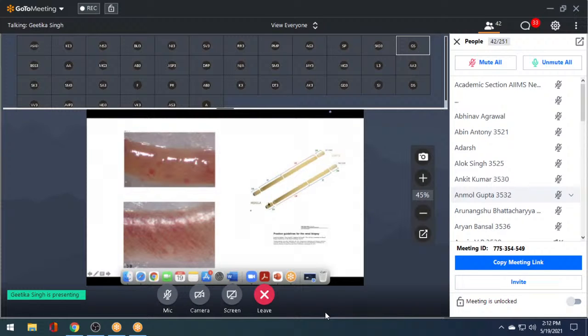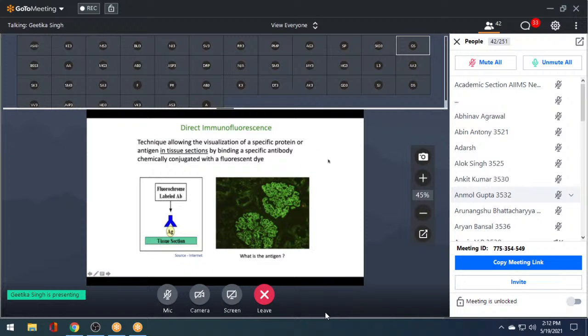So the way we divide it is not so important for you to know. What is important for you to know is we must divide it. If you're looking at kidney pathology, you need to have LM, IF, and EM. You need all 3 modalities. So after light microscopy, you've seen a lot of light microscopy. Let's talk about the IF.